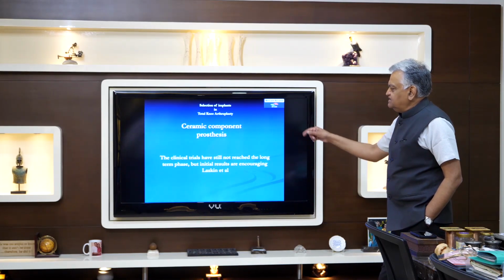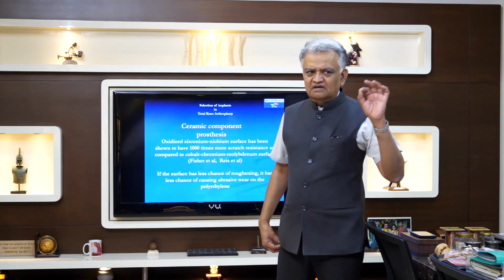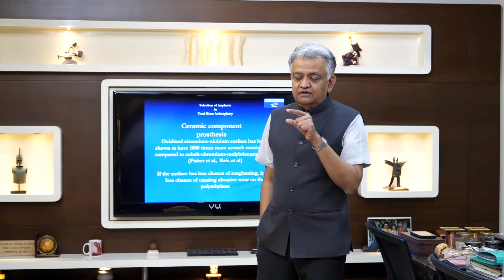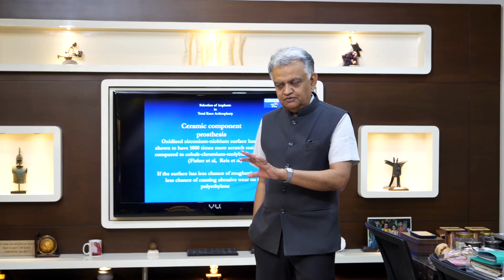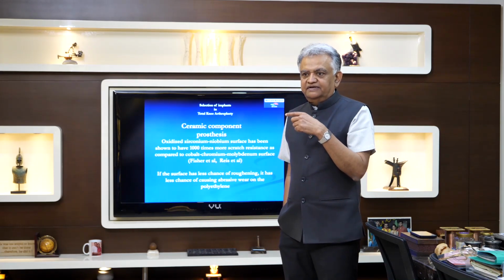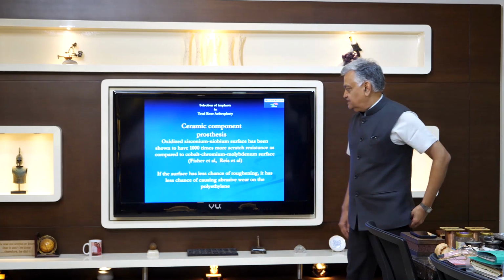Next. The one thing that I will go back one. Whilst all ceramic, true ceramic knees are still very, very early in their evolution and in their commercialization, ceramic as defined by Smith and Nephew, they have brought in a knee in which their standard femoral components, just the regular range of their components, are covered with a material called Oxinium, which they say is a ceramicized metal coating. So it has the characteristics of ceramic in terms of being highly polished and therefore reduced wear. And we'll talk about it as a separate subject.